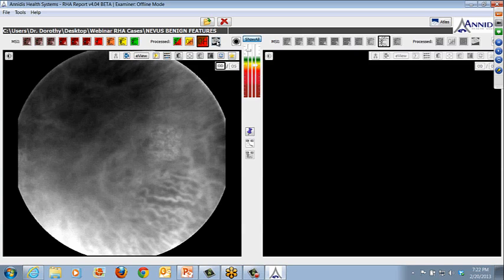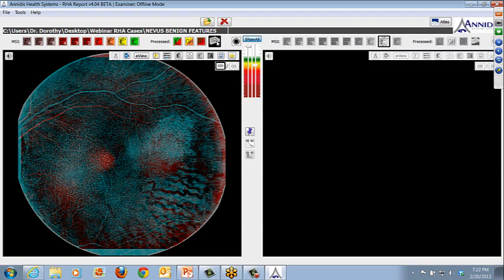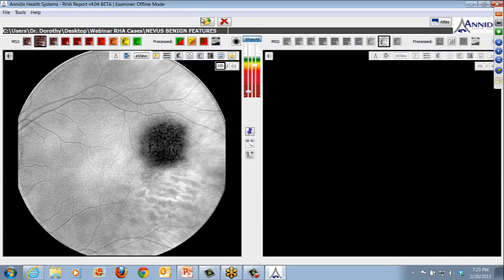And of course, the stereo map. Okay, that will give you some sense of not so subtle elevation, a little bit more significant elevation. Okay, definitely going to see a large elevated lesion with the stereo map. If you've got 1 millimeter or less, you may start to appreciate some elevation, but not in the very subtle cases. Okay.